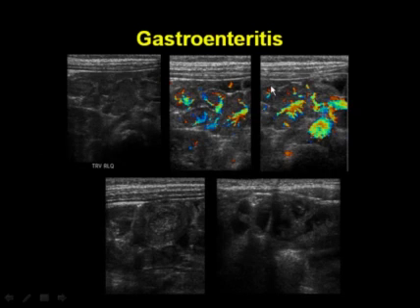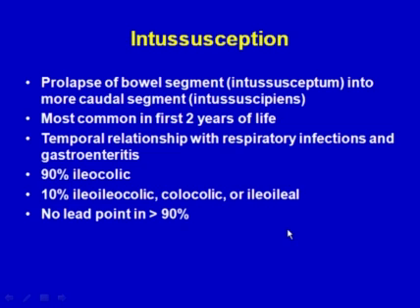So here the CT was necessary because the appendix could not be visualized by ultrasound. Here's another patient, also question of acute appendicitis. Again, multiple enlarged lymph nodes are identified sonographically with color. We see that they are hyperemic. And there's also mild thickening of the distal ileum. As you can see here, the wall is a little thickened. Here we see some loops in sagittal section, also mildly thickened walls. That turned out to be a gastroenteritis.